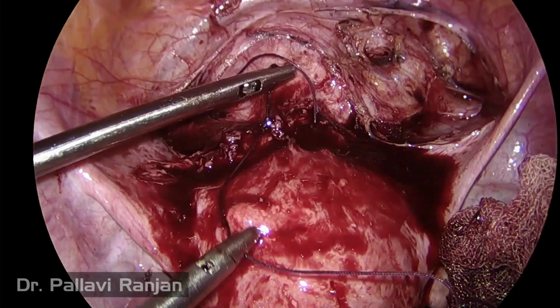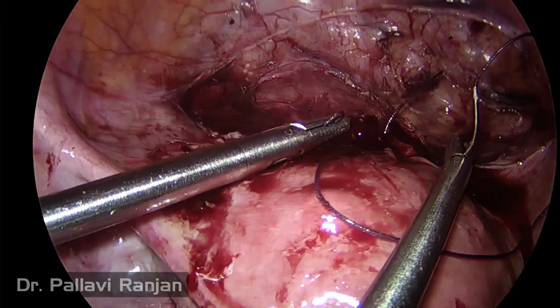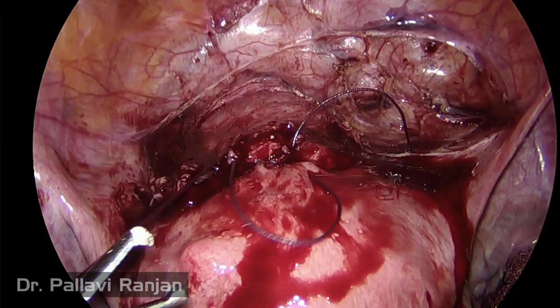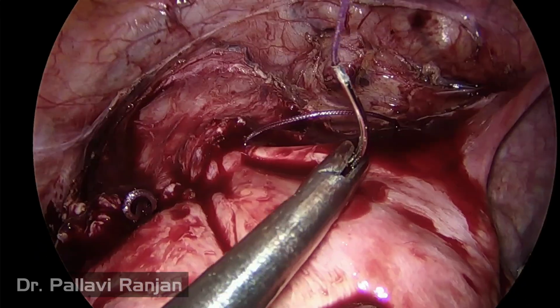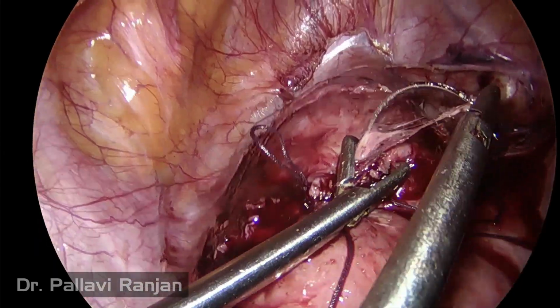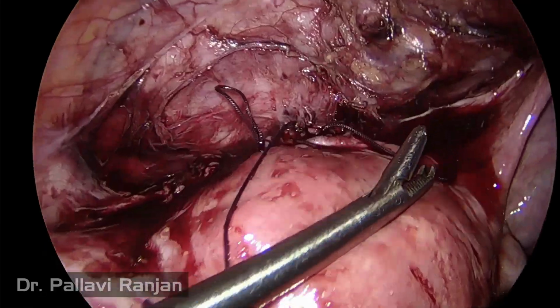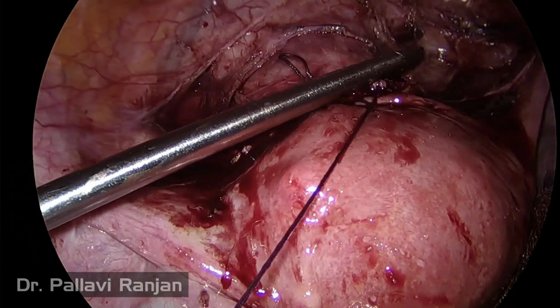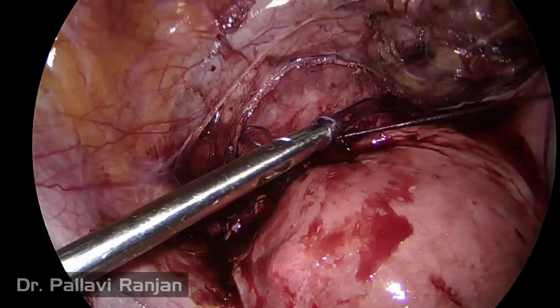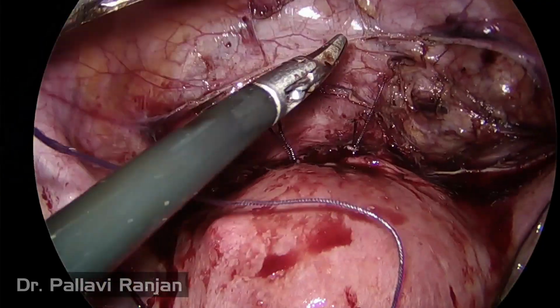So now we are taking the second layer, the same as you take in a cesarean section, but the depth is full thickness always. Like in myomectomy also you take full thickness bites, so here also you take full thickness bites. The dilator present in the uterine cavity also performs a function of enabling us to locate the cervical canal, so that we don't take the internal os in our stitches. So the dilator helps with that as well. Now we are done with our stitches, and we ensure adequate hemostasis is achieved.